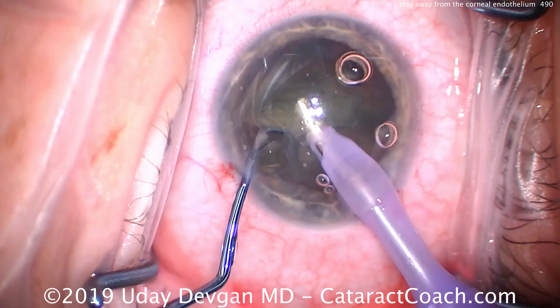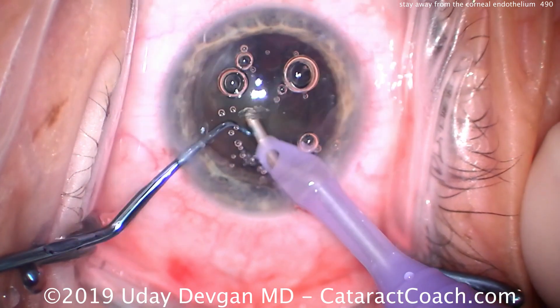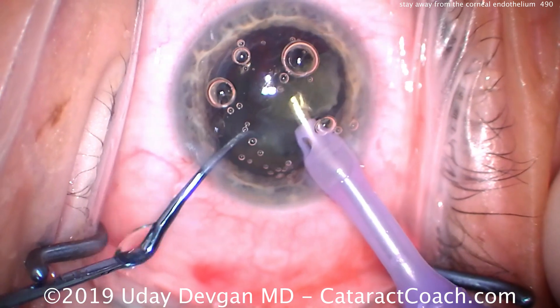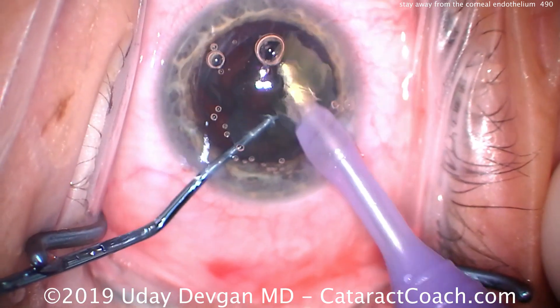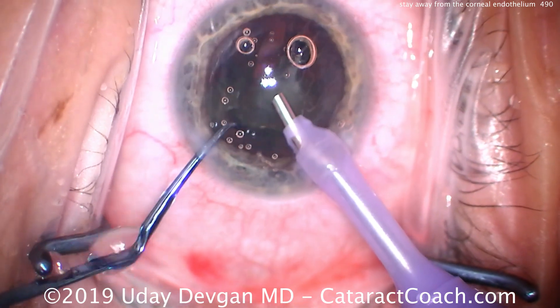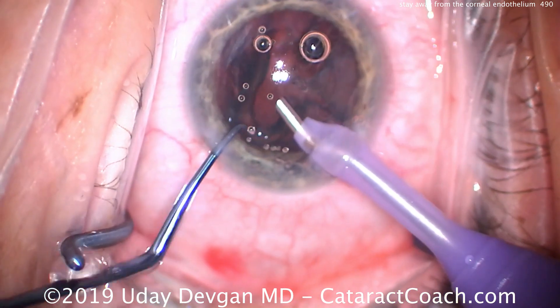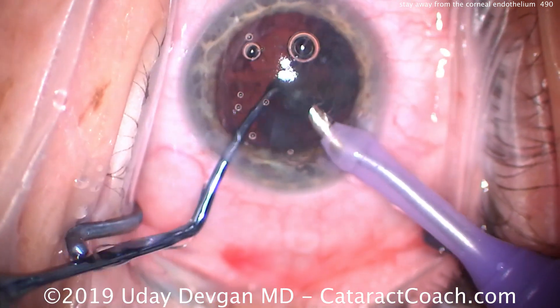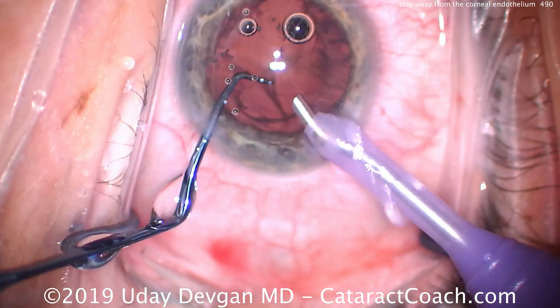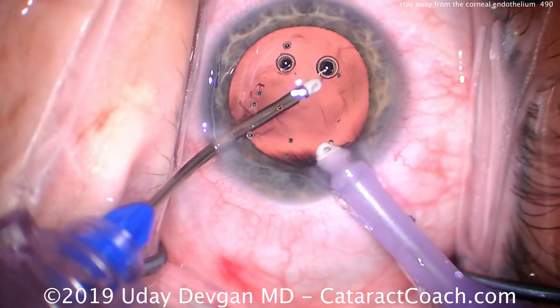We'll chop the nucleus, and as we do this, a little fragment of the epinuclear shell is going to be stuck against the corneal endothelium, and we've got an infusion of bubbles here as well. Ignore them — you have to learn to look through them. Don't evacuate or vacuum out the bubble or the piece of lens material that's right up against the endothelium, because in doing so you'll take away the dispersive viscoelastic that's protecting the cornea, and that's going to damage corneal endothelial cells.